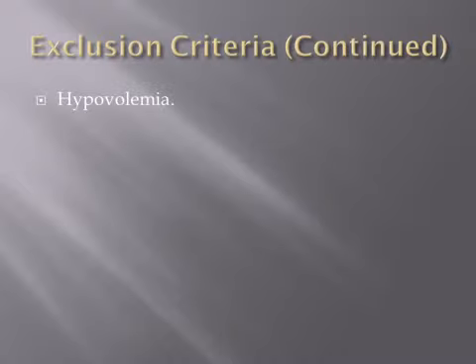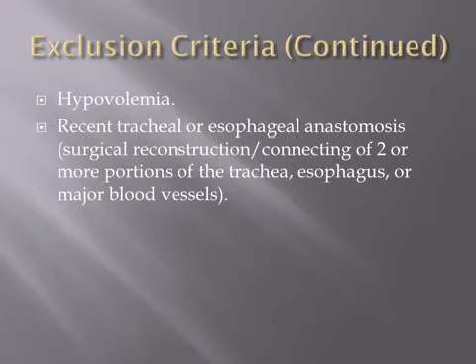also if the patient has signs of hypovolemia, or if the patient has had recent tracheal or esophageal anastomosis, which is surgical reconstruction or connecting two or more of the portions of the trachea, esophagus, or any major blood vessels.